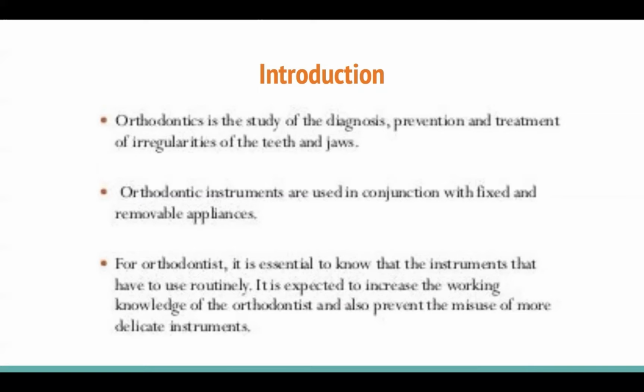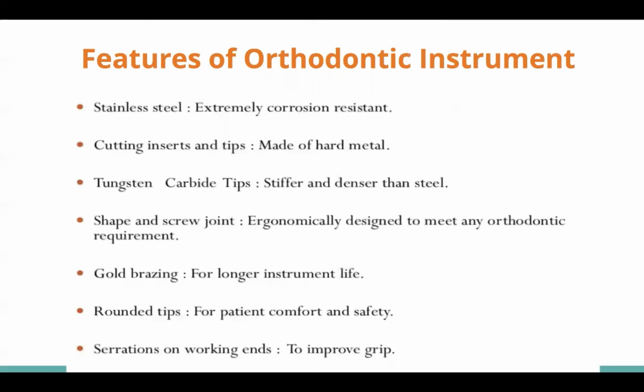So you need to know which instrument can't be used on the hard wire, especially the cutters, and which instrument you can use on which set of wires, so that you don't end up breaking the tips, because some of the tips of orthodontic instruments are very delicate and you have to use them appropriately.